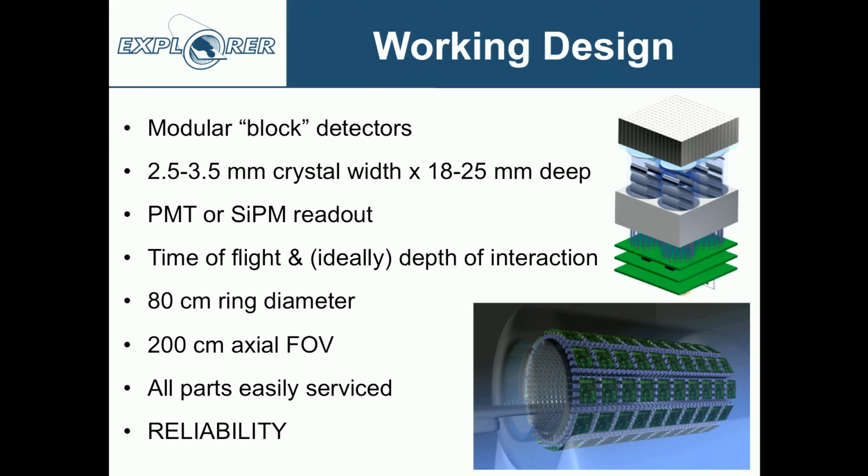And secondly, the point of this project is really to push the sensitivity as close to the fundamental limit as we can. And then to say, what can we do with that sensitivity? It may turn out eventually that we will develop applications that don't quite need that level of sensitivity and where in a clinical scenario it would be supported by a somewhat shorter scanner. That may be true in the future. But the point is to explore the limits here of what is possible. So we really want to keep the field of view at around that 2 meter mark.